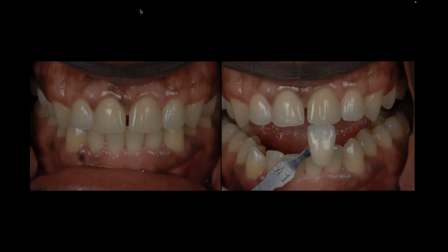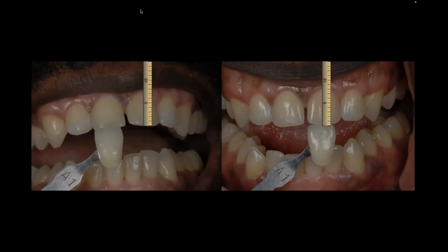And I want you to compare the difference in the 2 images when you look at them. Look at the number 8 specifically, and look at the coloration and the translucency that you see on the right side of your screen when the angulation is proper and the camera lighting is set proper. And look at that same tooth on the left side of your screen, right? I'd almost argue, because of the angulation, maybe a B shade tab should have been used there, because I see more of a yellowish hue in that tooth, but it's really because of the angle and the way the light is being reflected to it.